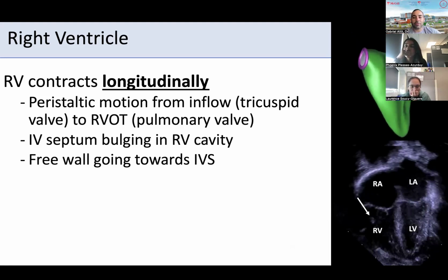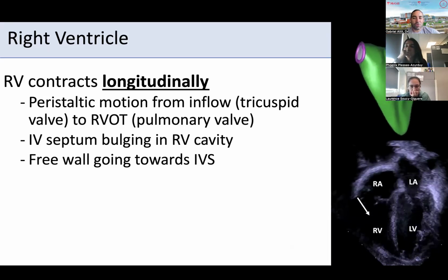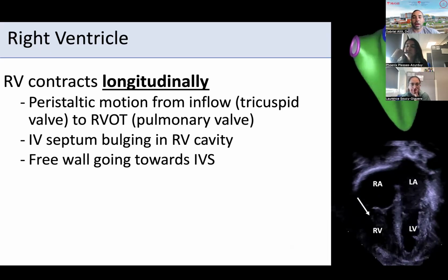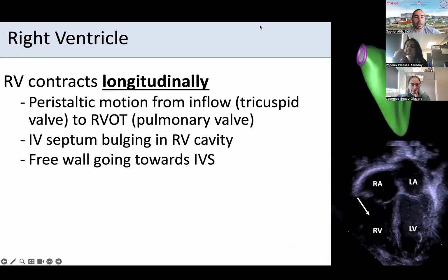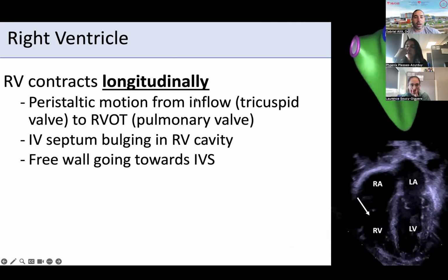You will typically, if you have significant regurgitation, these patients will have massive right atriums or massive left atriums. So if you have a relatively normal caliber LA or RA, or maybe it's a bit dilated but not massive like an Epstein, typically yes, there's some regurgitation, but it's not to the point that you're not having forward flow. So that's why in these particular patients, calculating RVO, LVO, and looking at the VTI in your outflow tract also provides good information on whether or not you're having good forward flow. Same thing if you have a lot of pulmonary insufficiency or aortic insufficiency.